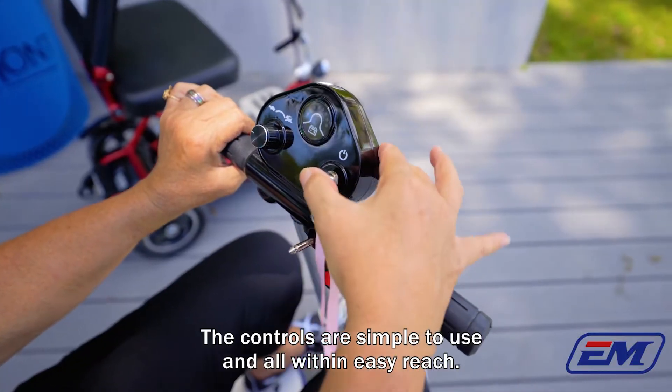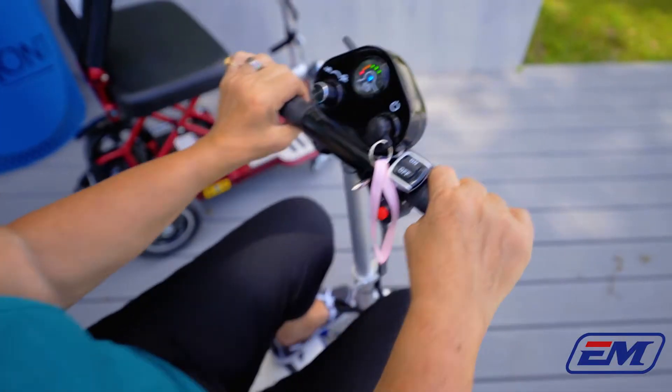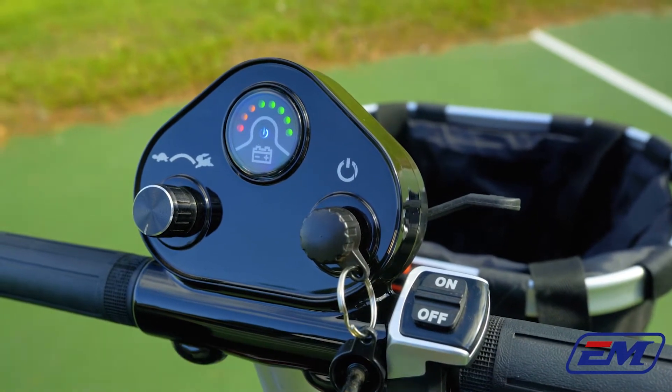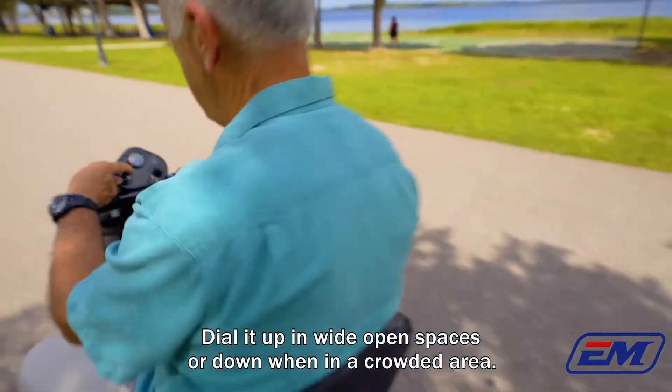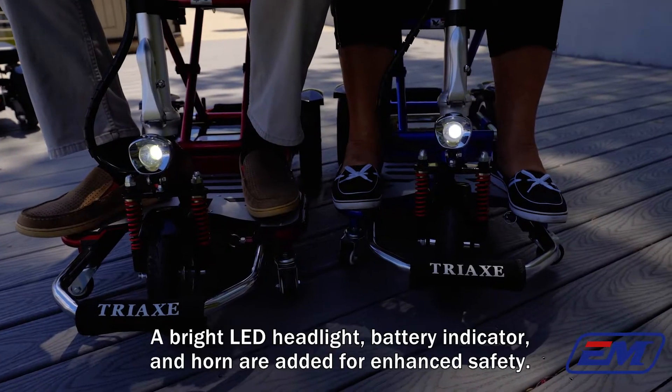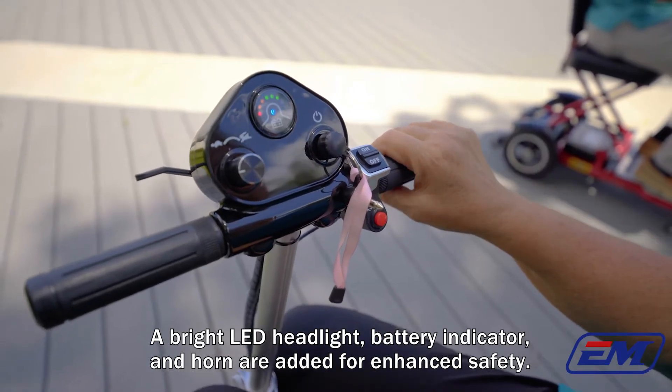The controls are simple to use and all within easy reach. The paddle acceleration with the speed control dial puts the power in your hands — dial it up in wide open spaces or down when in a crowded area. A bright LED headlight, battery indicator, and horn are added for enhanced safety.